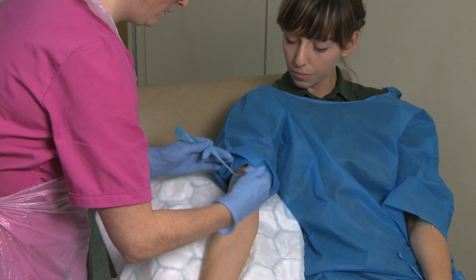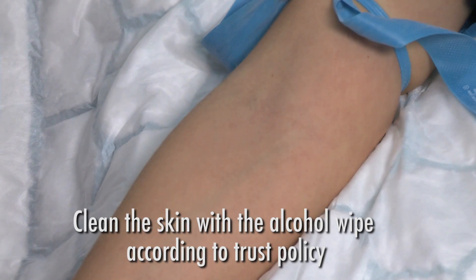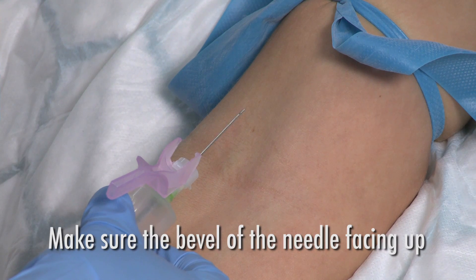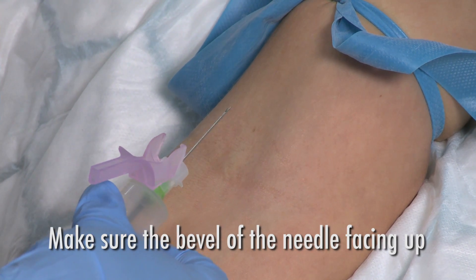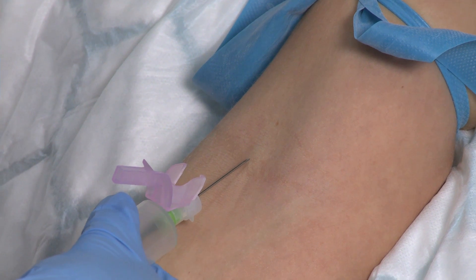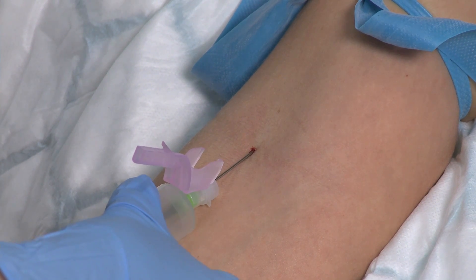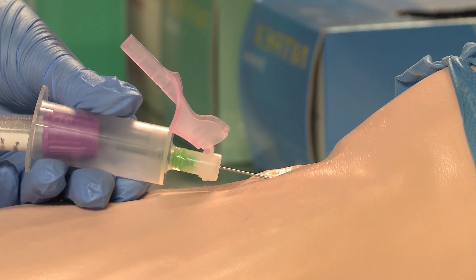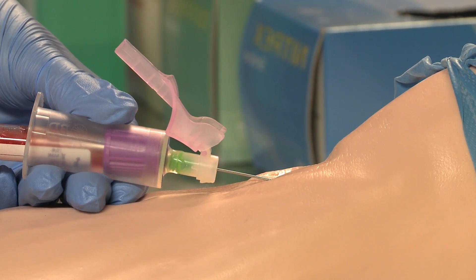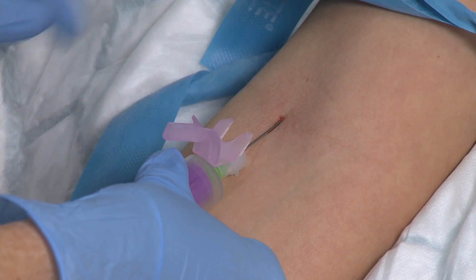The tourniquet should be tight enough to pinch the skin, but not so tight that it will cause pain. Clean the skin with the alcohol wipe according to trust policy. Always ensure the bevel of the needle is facing upwards. Once the needle has been successfully inserted into the vein, hold the barrel securely, ensuring it does not move. Push the blood bottle into the barrel and watch it fill with blood. Releasing the tourniquet at the earliest opportunity will reduce the risk of the sample haemolising.